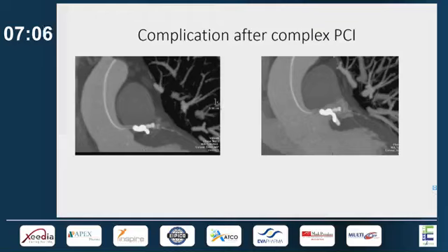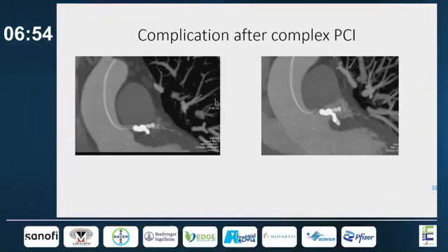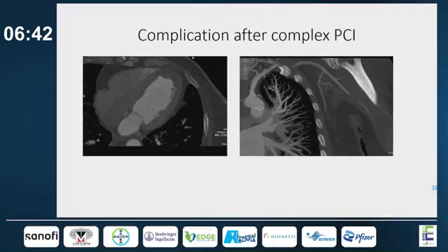This is a case of complication after complex coronary intervention. This case was referred for assessment because of the complication and the potential hazard to the ascending aorta. We can see here a PTCA wire that is free floating in the ascending aorta and is trapped behind an under-deployed and missed stent in the left main LCX. In the same patient, he sustained myocardial infarction with LV thrombus, and when we expand the field, we can see embolization to the brachial artery.